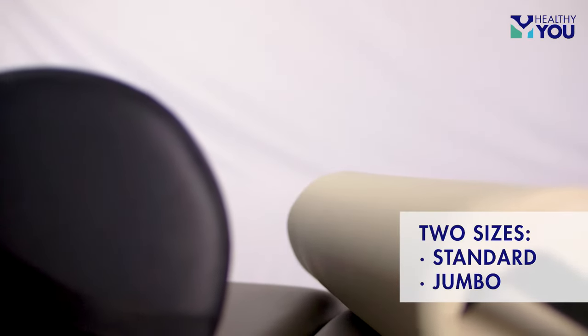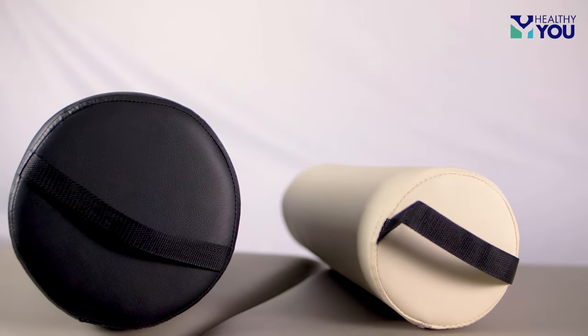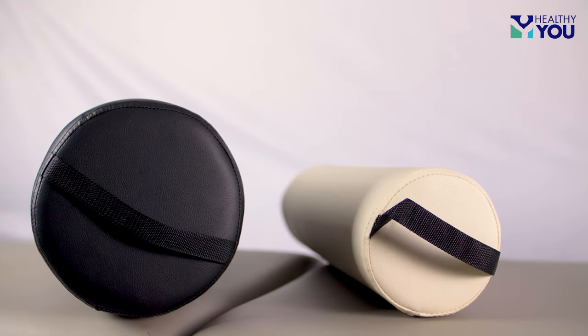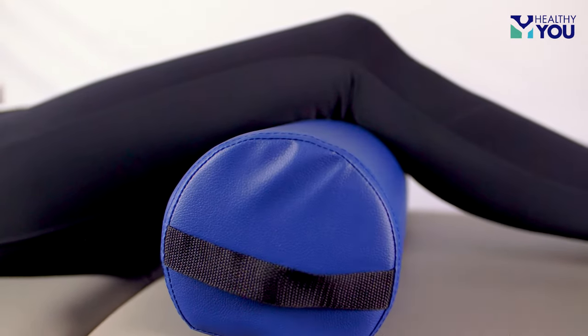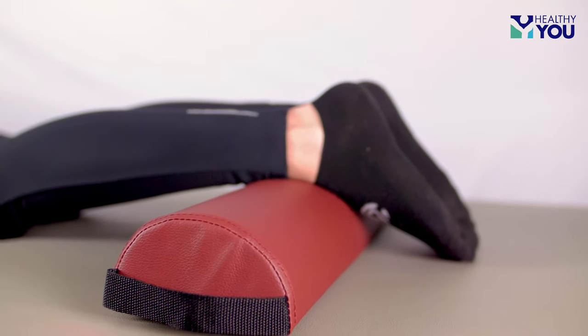The second variation to consider are the two sizes: standard and jumbo. Each shape is available in both sizes, creating a total of six height options, starting from three inches all the way up to nine inches. Depending on the size of the patient and the areas of the body you are trying to position, you may need an assortment of sizes and shapes on hand.